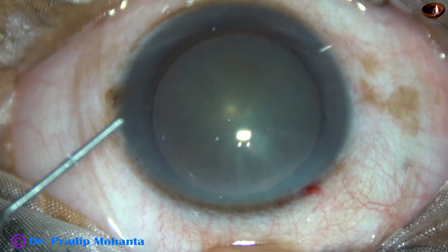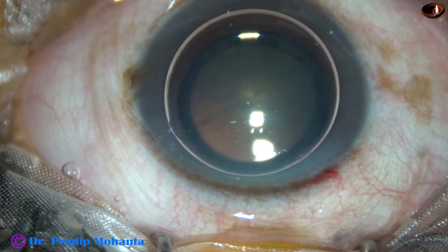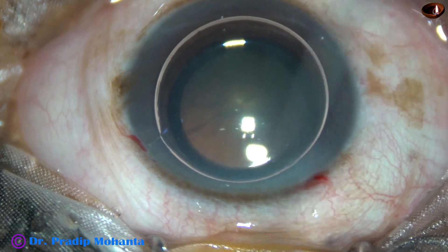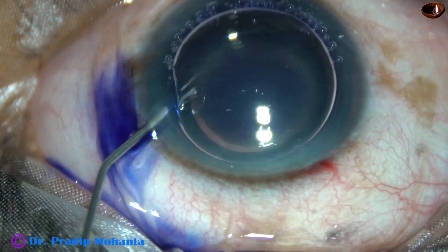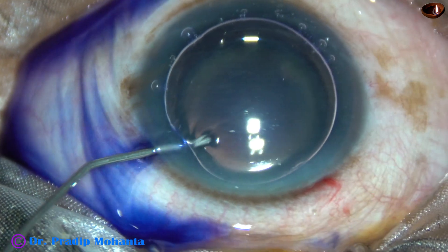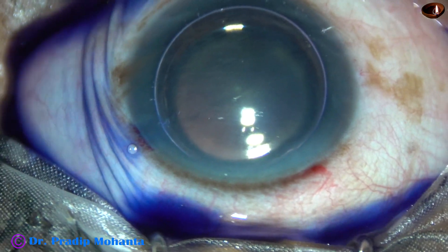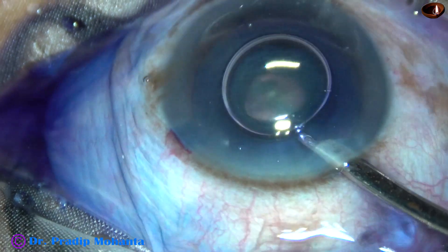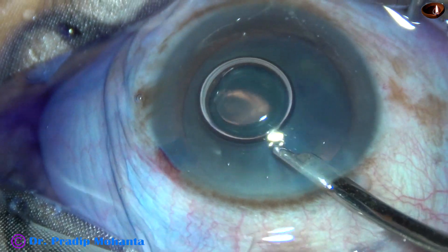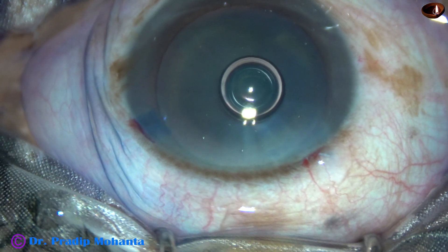An air bubble is injected to fill the anterior chamber. Beneath this air bubble, trypan blue dye is applied over the anterior capsule in such a way that the dye touches all parts of the anterior capsule. The dye is then washed out using a 23G Simcoe cannula and BSS.